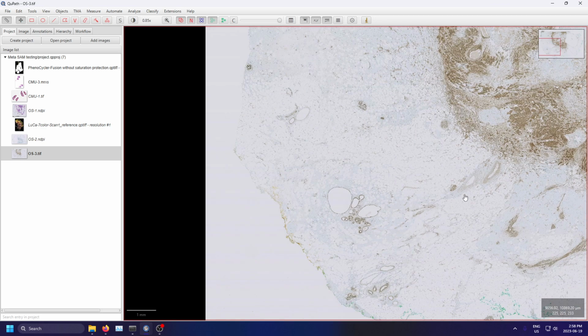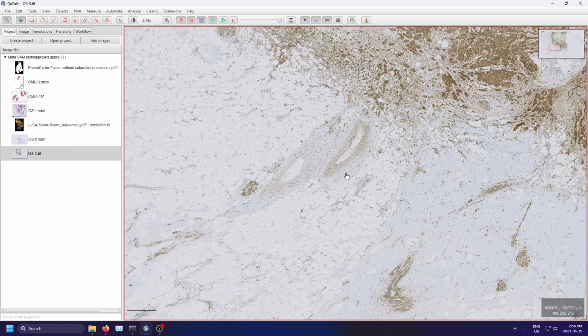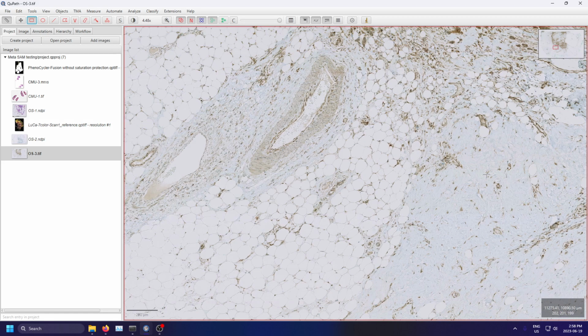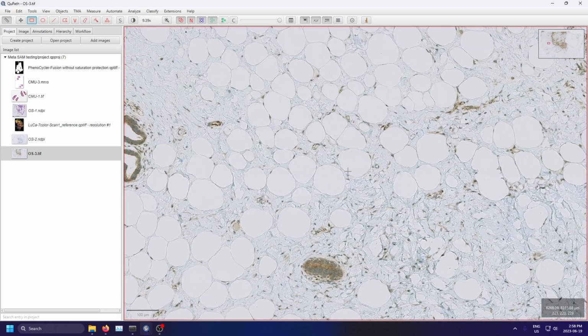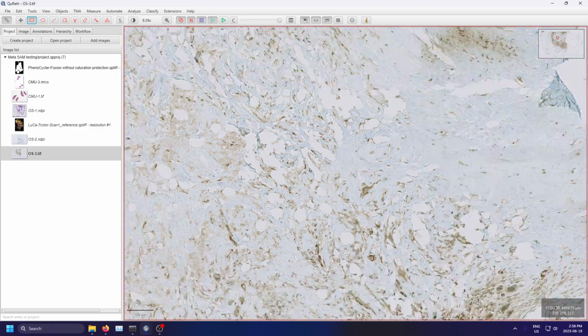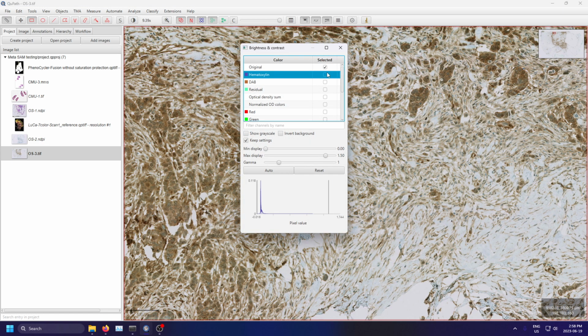So where do I see this being used in practicality? Well, right now, the Segment Anything Model, or at least the implementation in QuPath, only allows for segmenting one object at a time, so one object per human prompt. If I were to give it a cluster of cells, I don't know if I even have a DNA counterstain.